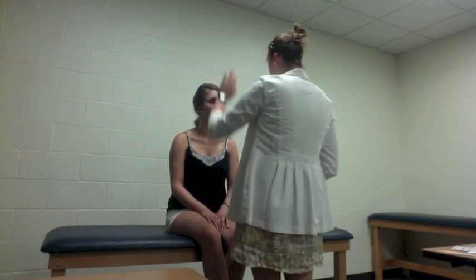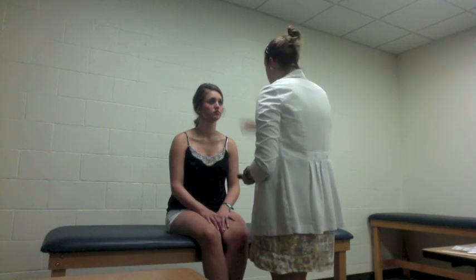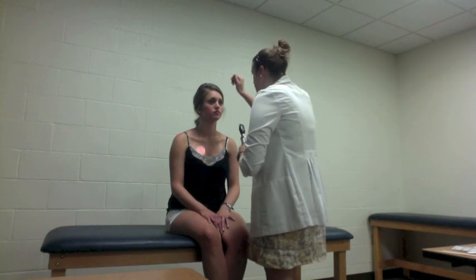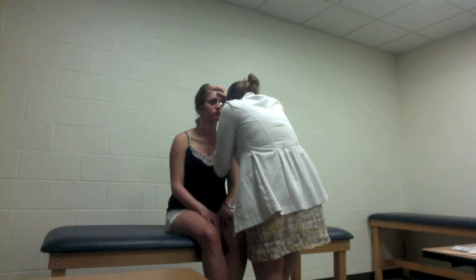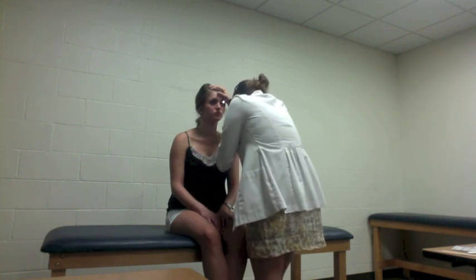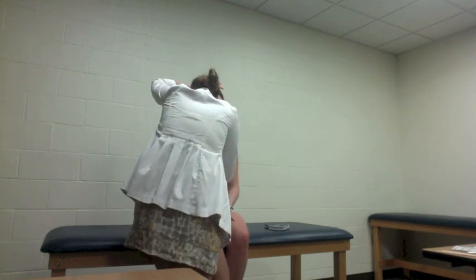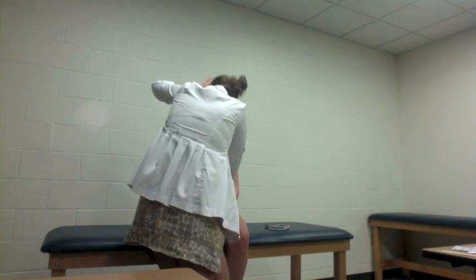I'm going to just touch your forehead, and I'm going to get really close to you, but if you feel uncomfortable, please let me know. I'm going to first test to see if you have the red reflex, like in a camera, and then I'm just going to visualize inside, okay? Focus at a spot on the wall and just keep looking. I might come into your eyesight, so just keep it there. You doing okay? All right. I'm going to do the same for this eye. Just keep looking straight. Okay, perfect. I was able to see in both eyes your optic disc. It's a little yellow, pinkish round closer to your nose, and then I was able to see your macula, which was a little darker. It might have made you tear up at the end, but everything was normal.